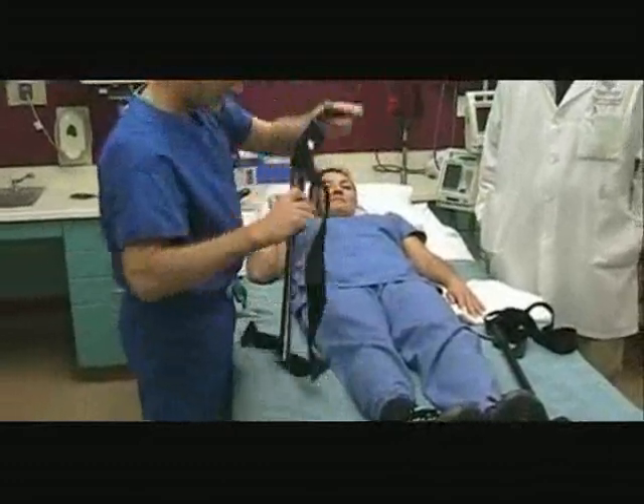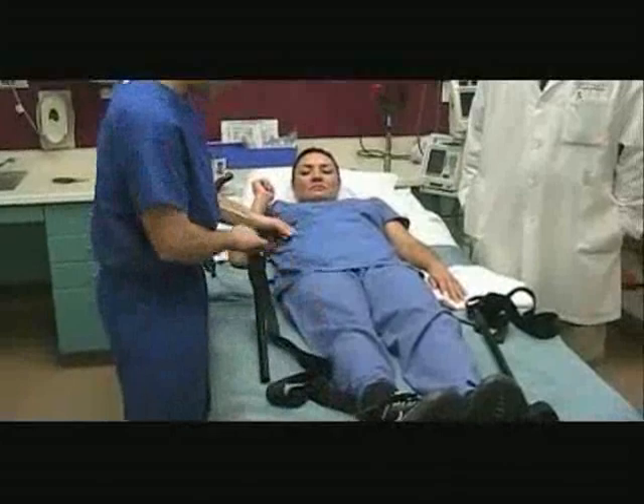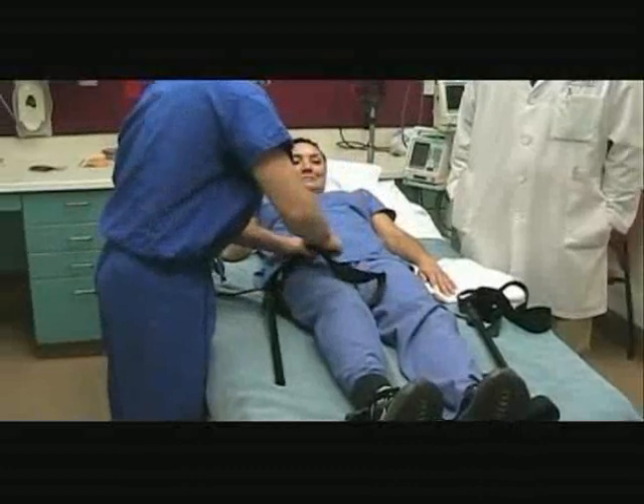This is the groin strap. The female buckle should sit anterior to the thigh and just snaps in place.